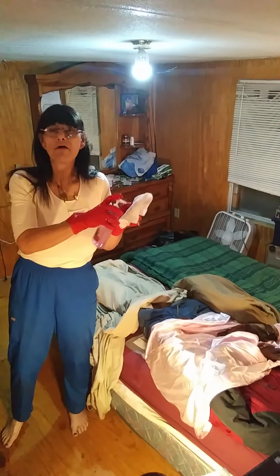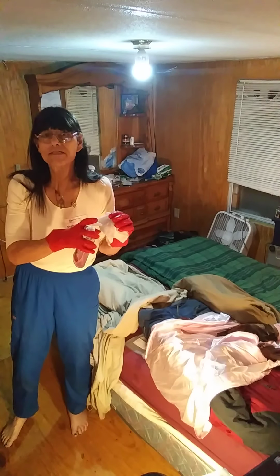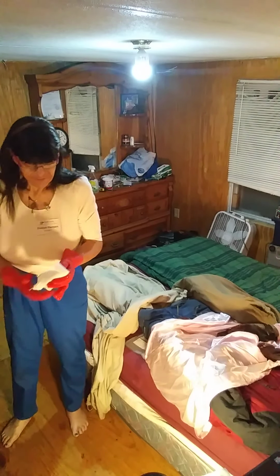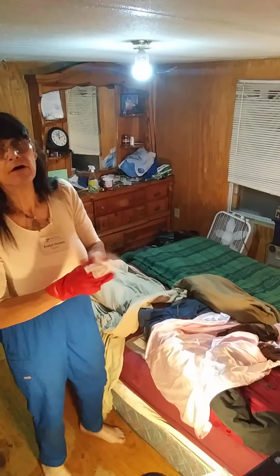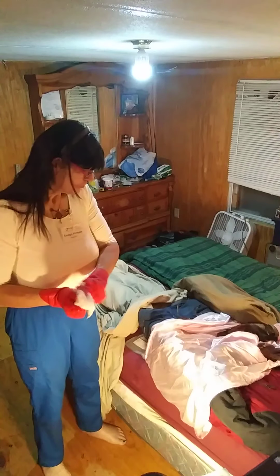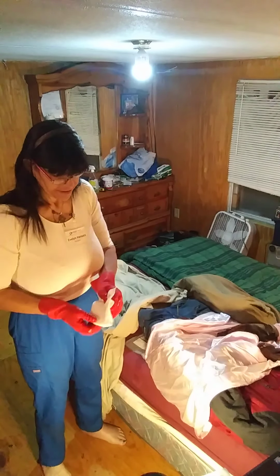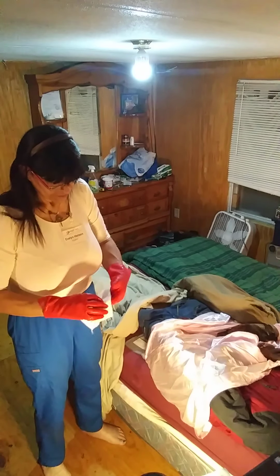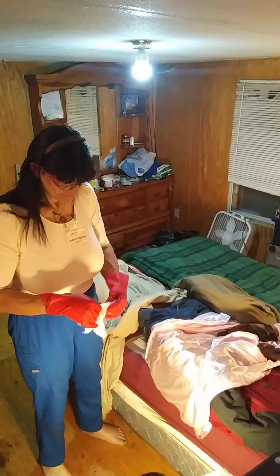I'm going to soap up my washcloth, just about a dime size tab, maybe 2. No more than that. I'm going to rub in the soap. Rub it in real good, making sure I'm not dripping on Mrs. Cheswick, okay? And my washcloth is folded into 4. I got 4 separate areas.